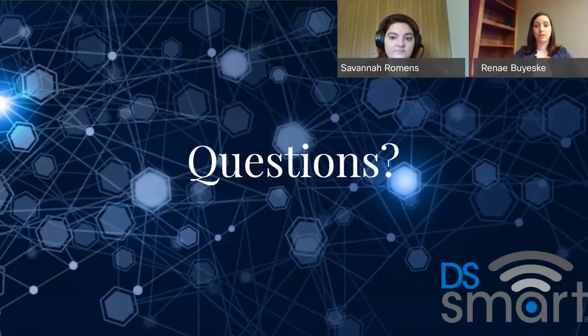And the second one is just the feedback saying how great it is to have the information, again, in the vitals record in real time. Within seconds, they were able to actually see that drop into the permanent record. And sometimes it's, I can't believe it until I see it. And then they actually hit the send button, and it actually shows up in their EMR. That's been a really great piece of feedback to hear, that they've been really happy with that solution.